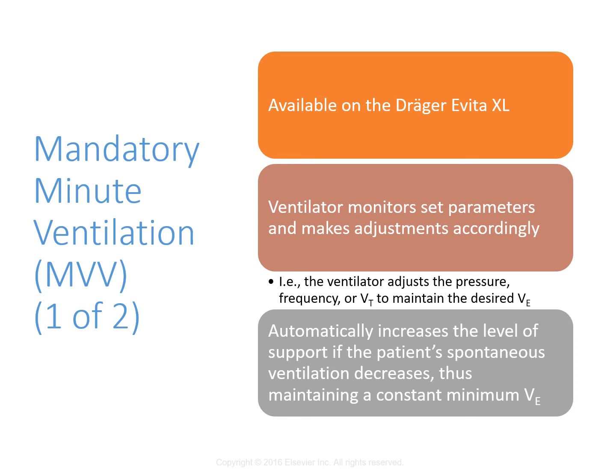So a little bit lower. So 75% or less might be perfect if a patient's slightly alkalotic, or for patients that are in SIMV, setting it at 90% of the IMV might be appropriate as well. So this is another method that could be used, but there's just not a lot of evidence behind it currently.